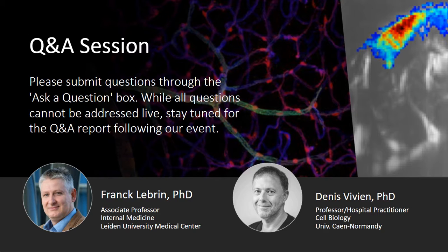And the second main point for me is also to get images which could include the whole brain. Because at least for ischemic or hemorrhagic stroke, you don't know where the lesion or the clot is located, and by using CT scan or MRI, you can have access to the whole brain. And it is the main limitation.